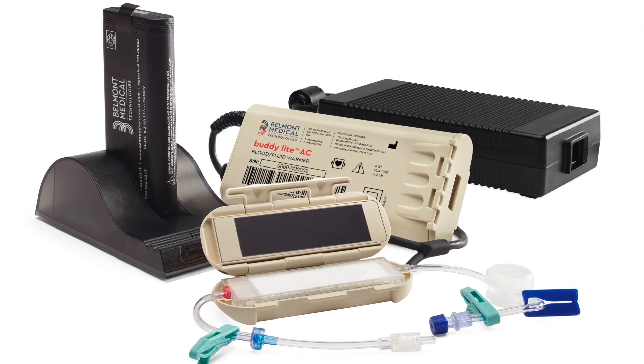The Belmont Buddy Light system consists of the heater unit with battery compartment, a battery pack, and battery charger. The Belmont Buddy Light AC additionally includes an AC power pack for continuous use.